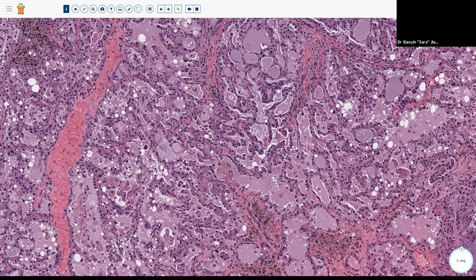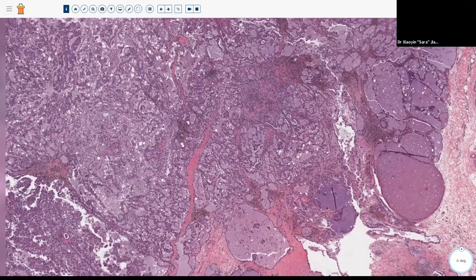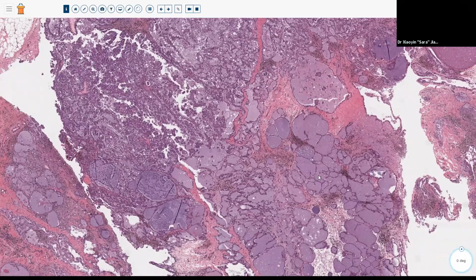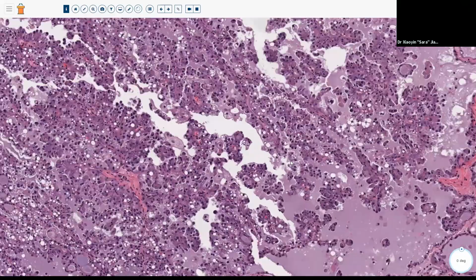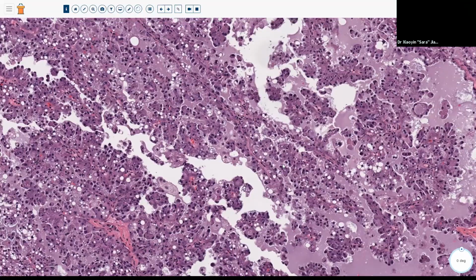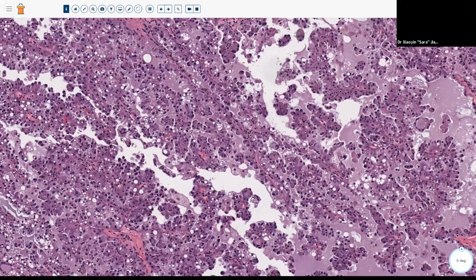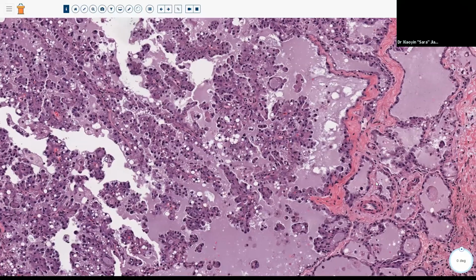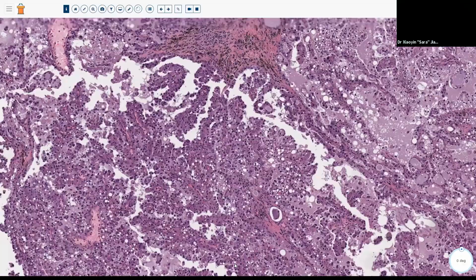And this tumor can have a lot of cystic components. And if we back up, we can see that there's some cysts. Some of these can be predominantly cystic, so you really want to make sure you're sampling the wall of the cyst to make sure you get these tumor cells. And you can get these bubbly secretions. They can be eosinophilic, as we can see here, but bubbly, eosinophilic, almost to me has kind of an apocrine pattern to it. And you can get a microcystic pattern, you can get tubular patterns, you can get more solid areas as well.